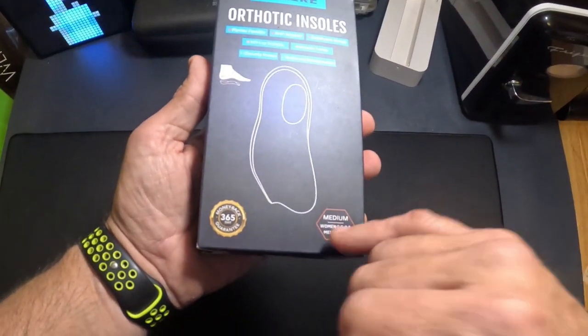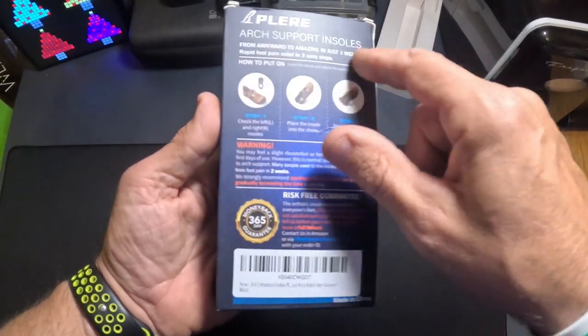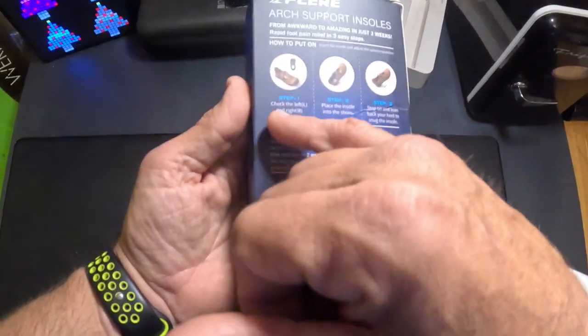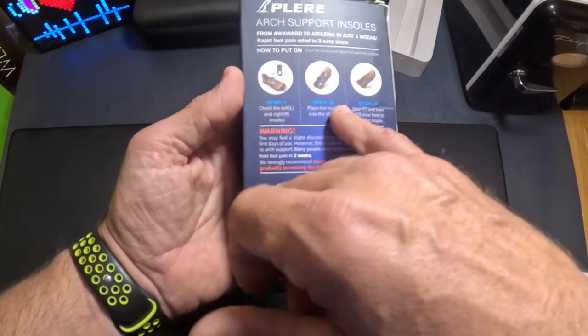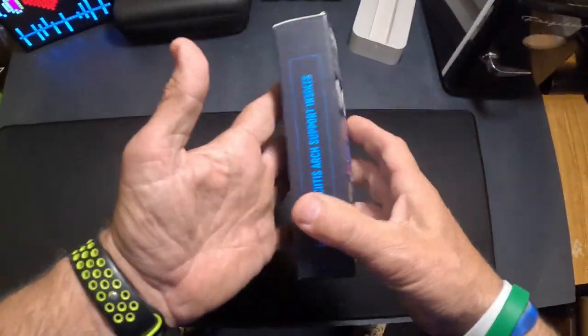I got mine in a size medium. They come in small, medium, and large. Looking at the back here, to put the arch supports in, you basically just slide them in over top of your existing insole. All you do is drop them in there.